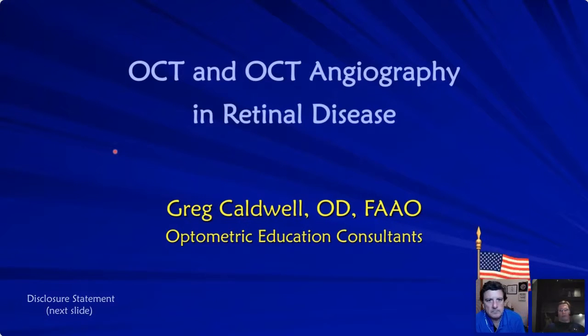Well, welcome to our webinar tonight with Optometric Education Consultants. Tonight's topic is OCT and OCT Angiography in Retinal Disease.